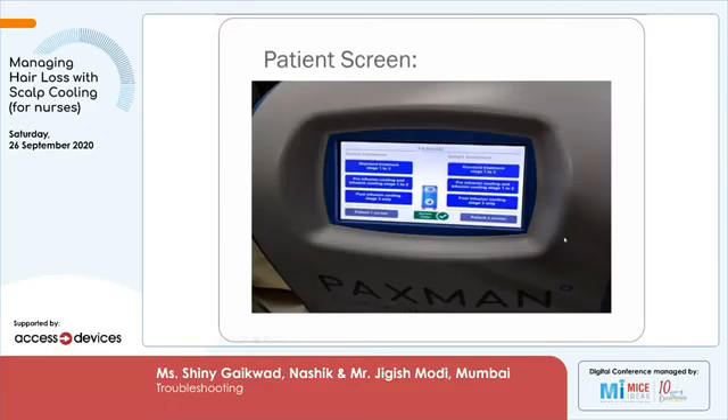This is the screen you will see. On both sides there are Stage 1, Stage 2, Stage 3. Many times we get calls from nurses asking how to proceed after pre-medication, or saying there was a power failure during chemotherapy and the machine switched off. In such a case, you can again start from Stage 2, continue until the entire chemotherapy is completed, and then go to Stage 3 automatically.